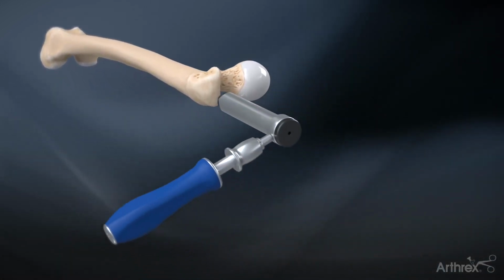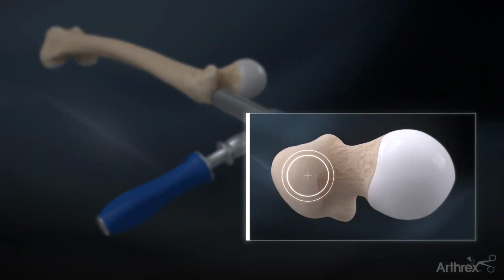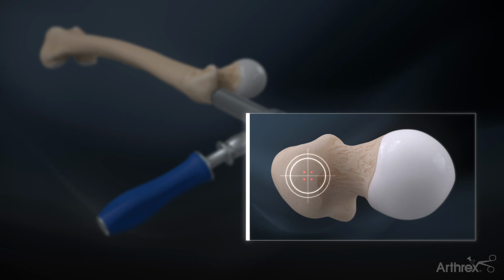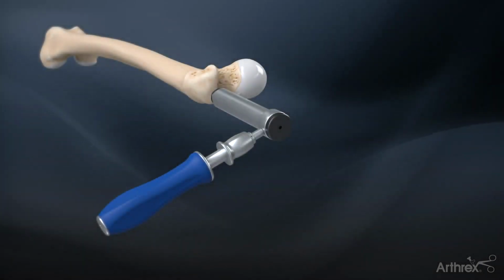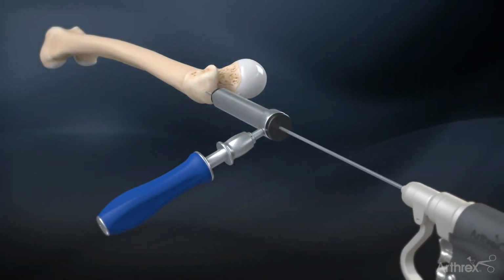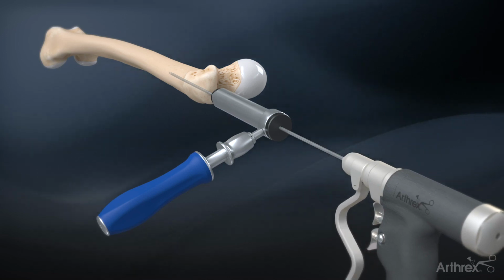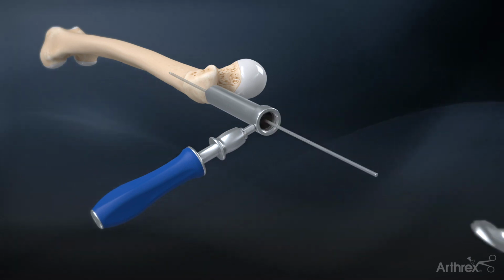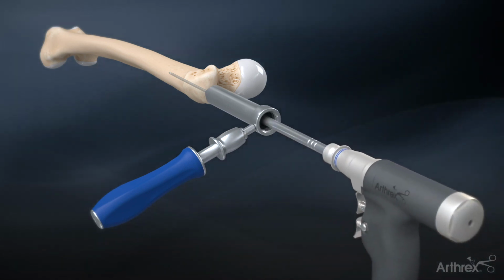Determine the entry point for the nail at the tip of the greater trochanter. This point may vary slightly depending on the patient anatomy and fracture pattern. Insert the 3.2 mm guide pin through the soft tissue protector by aiming towards the central axis of the femoral shaft. Remove the black pin guide and ream over the guide pin with a 13.5 mm cannulated entry reamer.